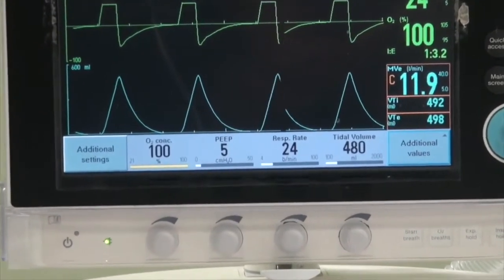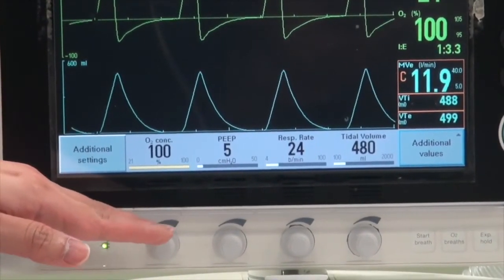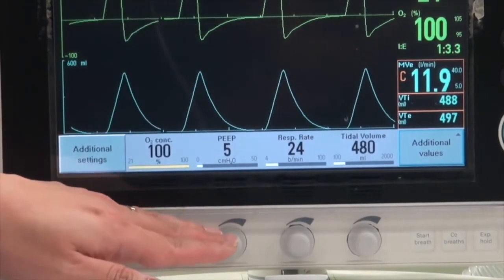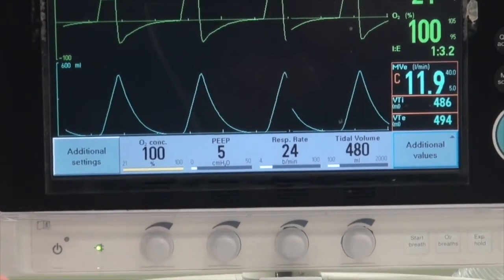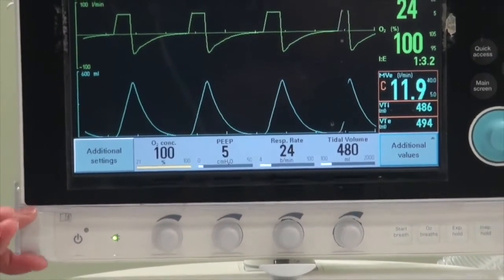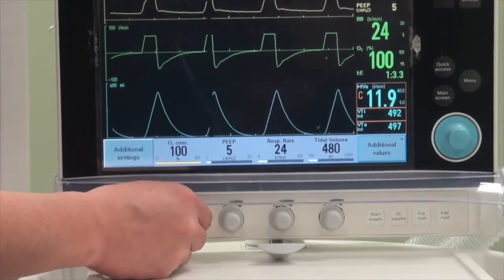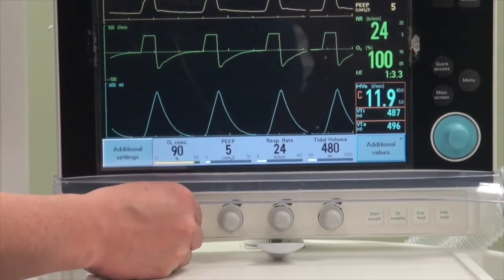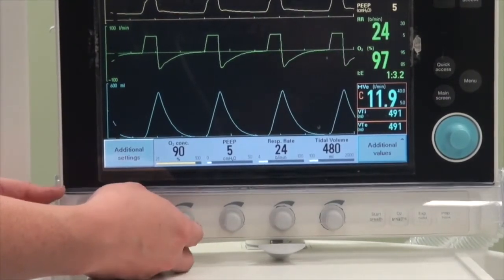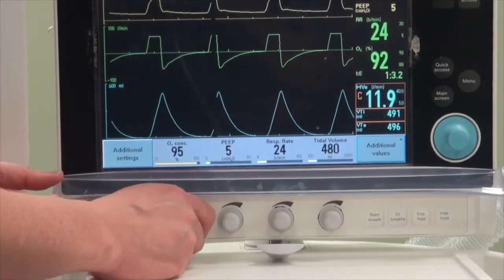Depending on your mode, you have access to quick settings such as delivered oxygen, PEEP, respiratory rate, and delivered tidal volume in volume control. You can make a quick adjustment by lifting the cover and turning the dial to the desired level — at the bottom, you do not need to press any Accept button and changes are made instantly.